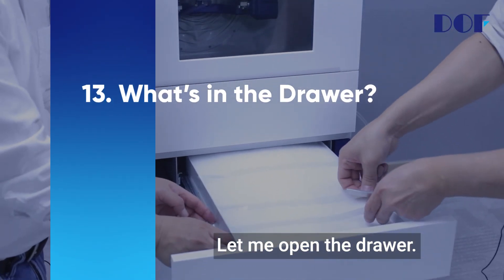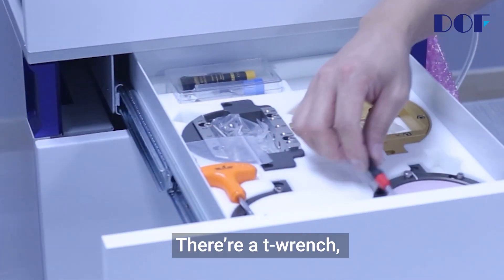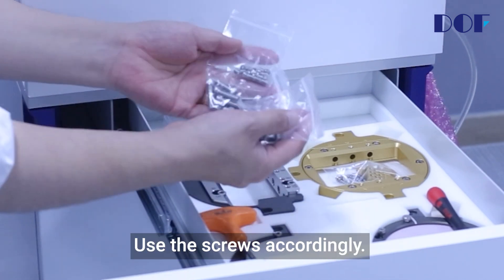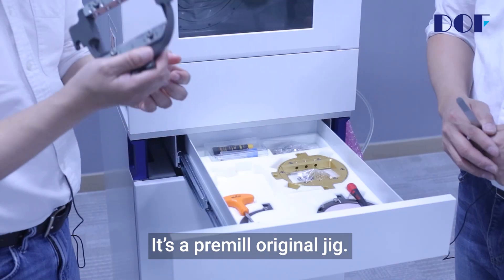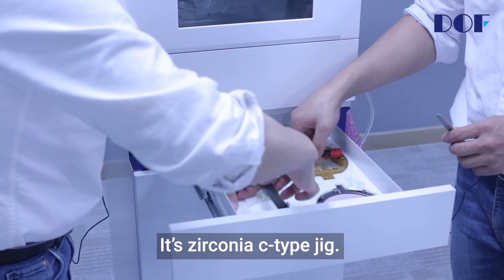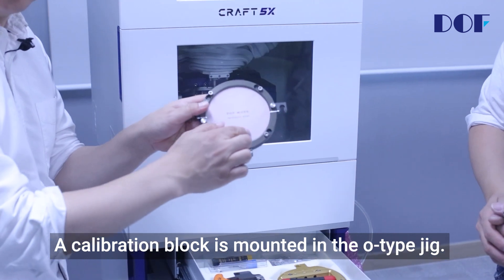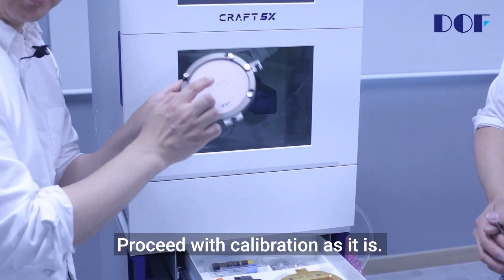Let me open the drawer. There are a torque wrench, a screwdriver, and screws — use the screws accordingly. There's a pre-mill original jig, a glass ceramic jig, a zirconia C-type jig, and lastly an O-type jig. A calibration block is mounted in the O-type jig. Proceed with calibration as it is.